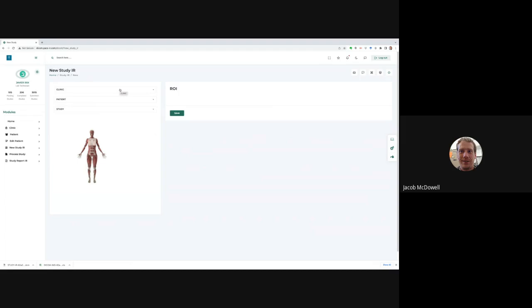It sounds like you haven't seen one. No. Okay. It's real basic and real simple. The more complex the software is, the more time is spent looking for files and moving things, and the harder it is, the less people want to use it. Because what's happening with thermography is that in order for them to maintain these really cheap interpretation prices, a breast thermography interpretation is about $45 to $55.